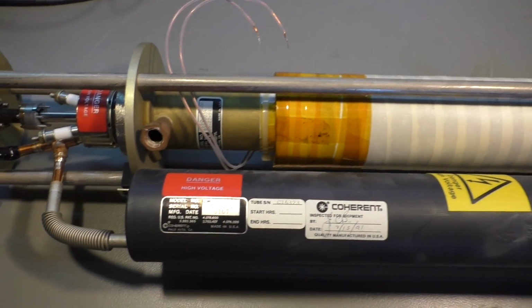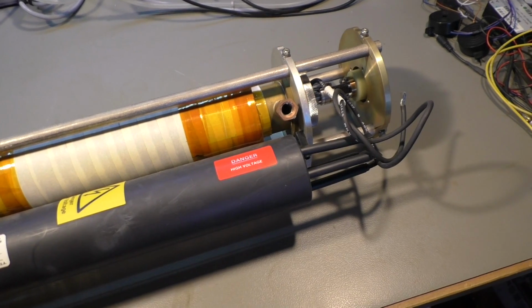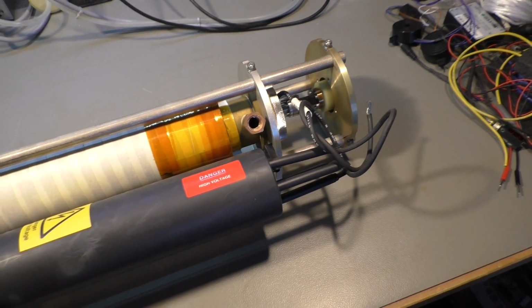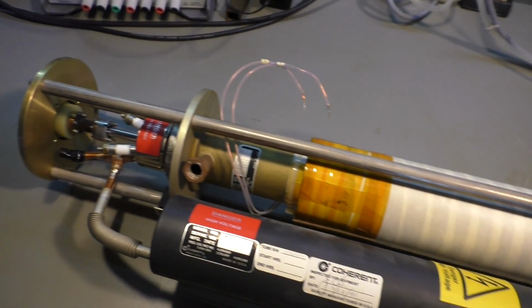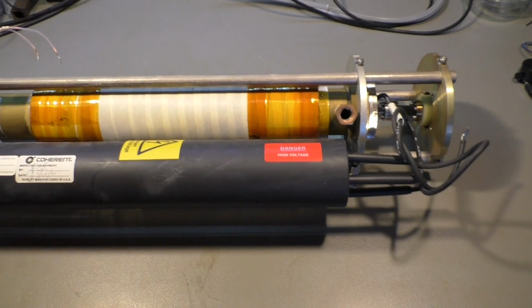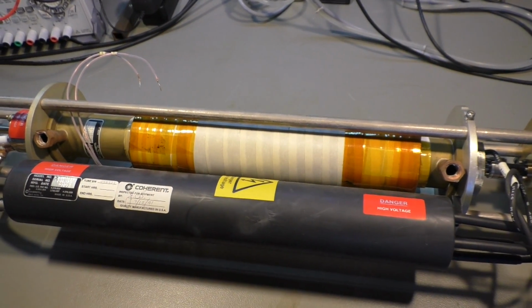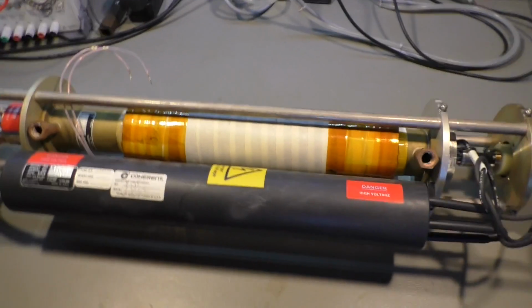Okay, let's see what we can do with this tube here. It didn't start up inside the machine, so there was either a power supply problem, or what I suspect is this tube just has too many hours on it. Of course it could be refurbished, but that's not something I would like to do. I'd rather take it apart.